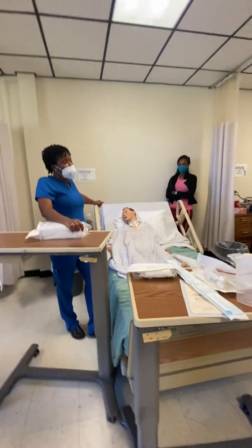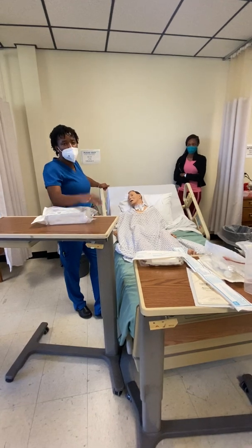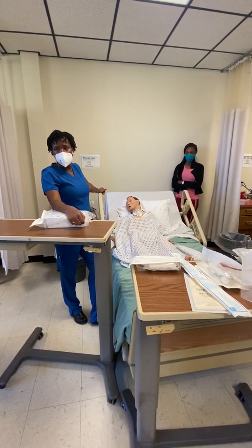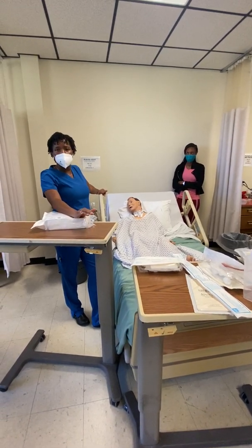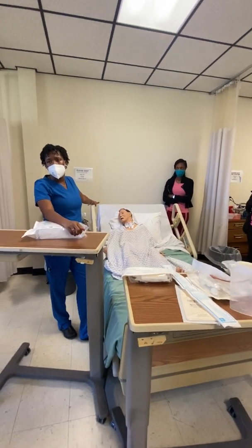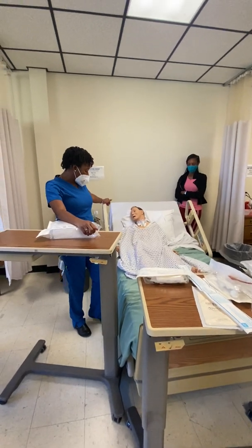So when you come in that day for your competency, you will have a chart on that bedside table. You have to check your order, or at least tell me you're gonna check it. You can't insert a Foley catheter without a physician's order. You'll see in the chart, physician's orders, just flip it up and you're gonna see Foley catheter to gravity drainage, okay? And that's gonna give you your order. You're gonna identify your patient.